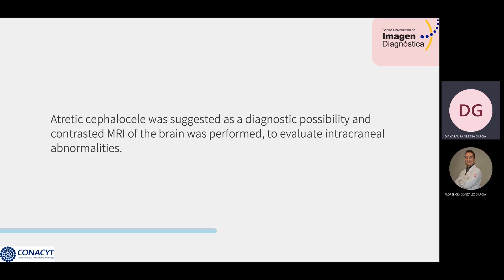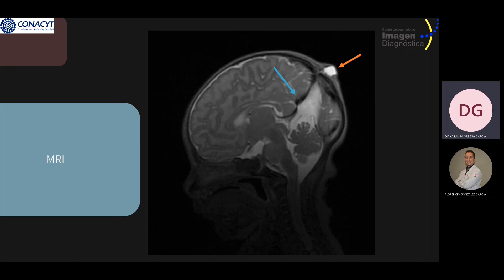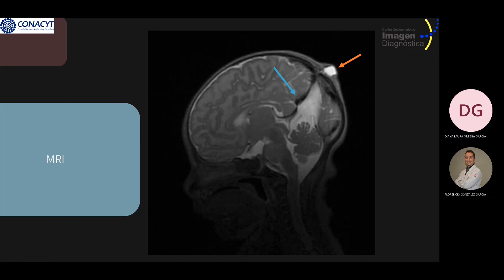An atretic cephalocele was suggested as a diagnostic possibility and contrast MRI of the brain was performed to evaluate the intracranial abnormalities. The T2-weighted images show, indicated by the orange arrow, an extracranial lesion hyperintense on T2 with a small bone defect, and the blue arrow shows a vertically oriented persistent primitive falcine vein and adjacent fibrous stalks connecting the cephalocele through the calvarial defect.